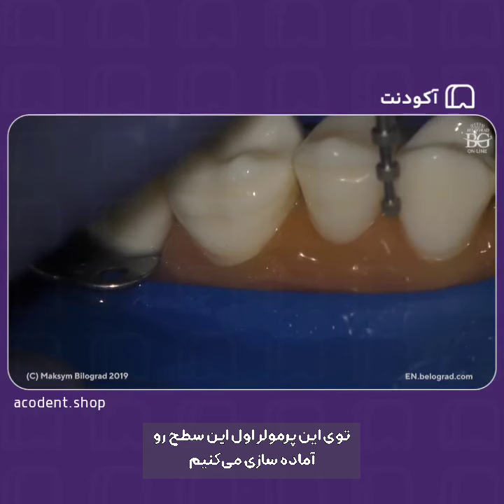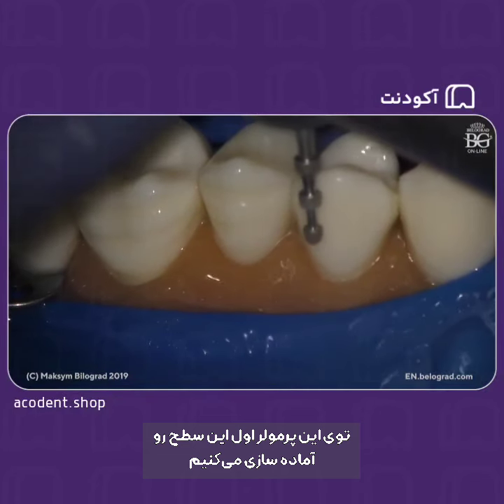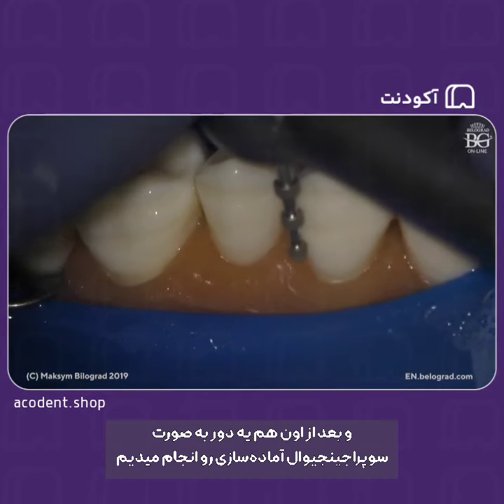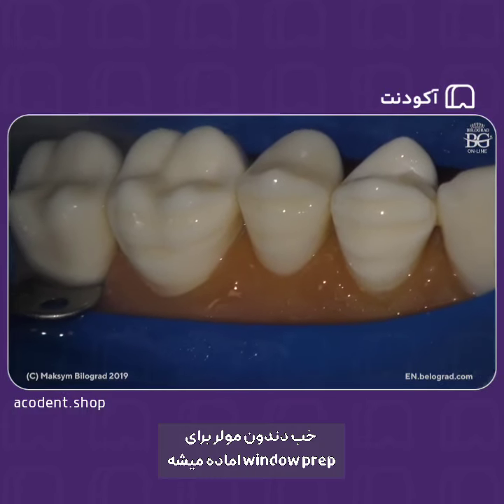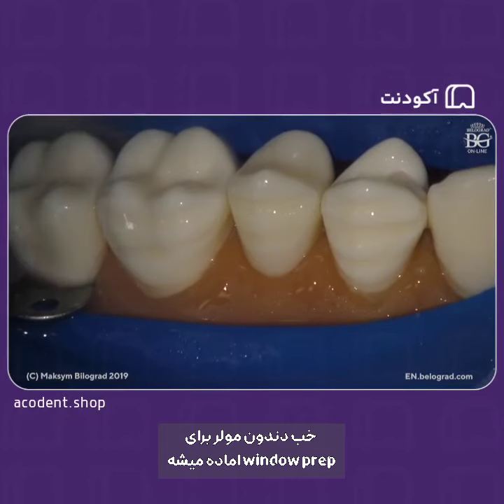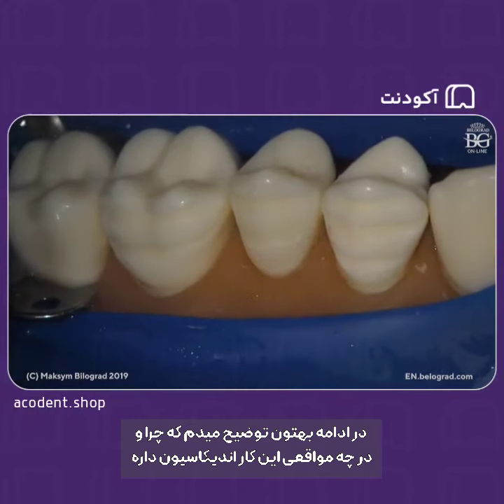This premolar will be prepared. This part we will do prep, and also supra, it has to be done supra-gingival. Okay, this is important. What else? The molar tooth will be prepped for window prep. I will explain why, in which kind of cases, and what the indication is.